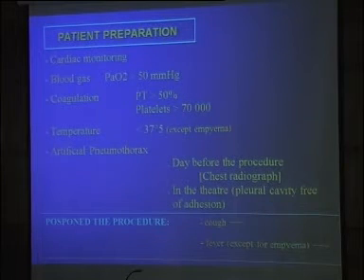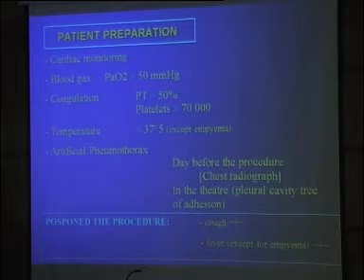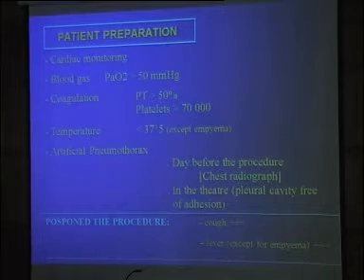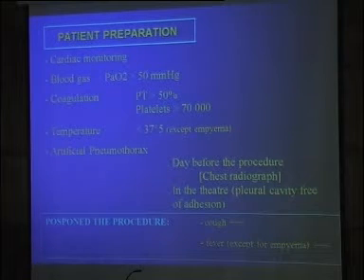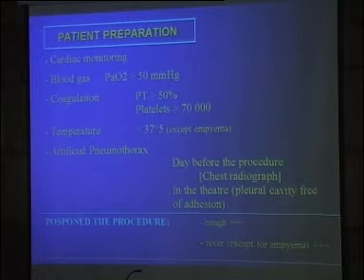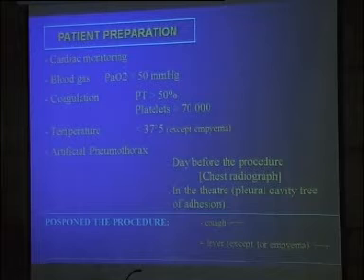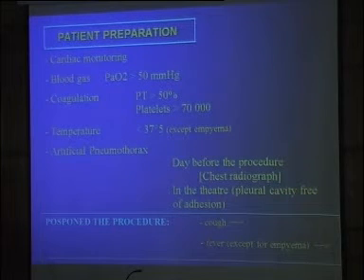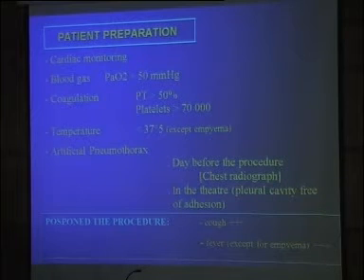What about the patient preparation for such a procedure? Usually in Marseille we have a privilege because we have a dedicated thoracoscopy room. We have an endoscopy suite with a bronchoscopy room for bronchoscopy, interventional bronchoscopy, and just close to this room we have a thoracoscopy room. We have 2 anesthesiologists dedicated to bronchoscopy and interventional pulmonology. Of course, it's a privilege, but we try our best to make this procedure easier.